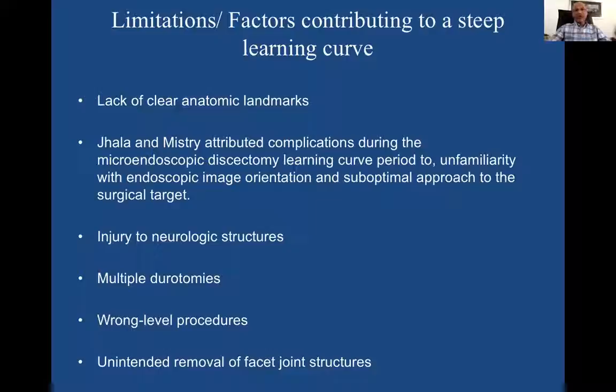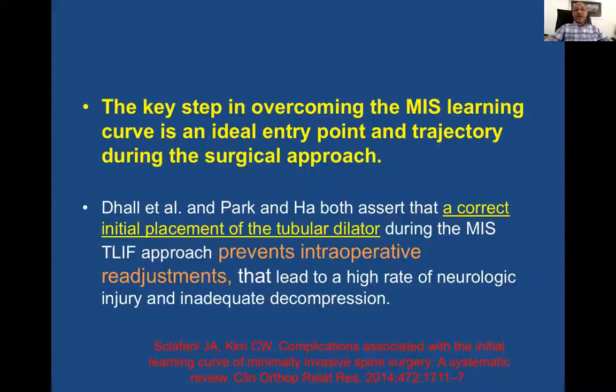So the key step in overcoming the MIS learning curve is ideal entry point if you're talking about some kind of tubular dilator that we are putting in, and to have the trajectory in the line of the surgical approach. For example, if you're doing endoscopic discectomy, you need to be coming really perpendicular to the disc or wherever the disc is coming out. The sequestra is inferiorly, you come down inferiorly. If you're thinking medially, you come medially. So you adjust yourself accordingly. So all that can be overcome when we know the anatomy and the pathology of the patient beforehand.